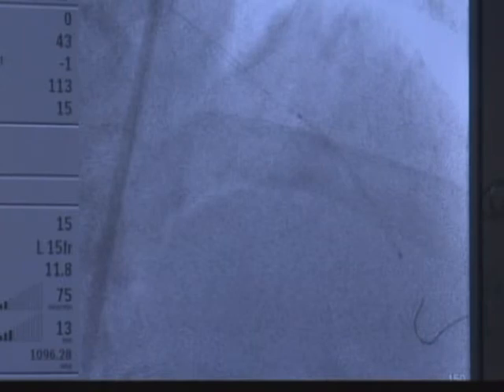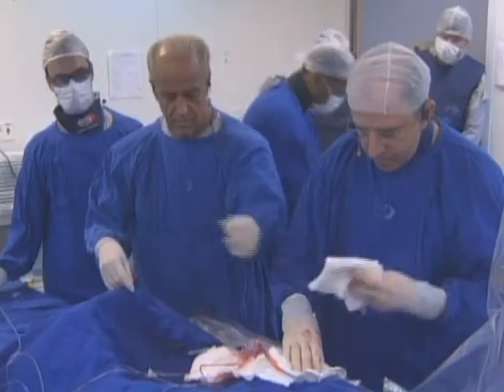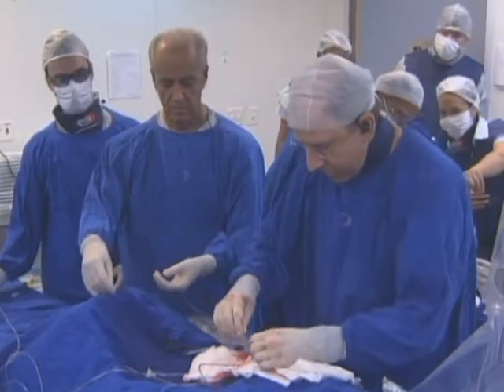Yes, I think IVUS is very helpful in this situation, in this true bifurcation. But even in my hospital, my cath lab, people will do differently. Different people do different strategies. For this particular case, to answer your question, maybe we would do 6 French transradial. 90% of the cases are by radial approach.